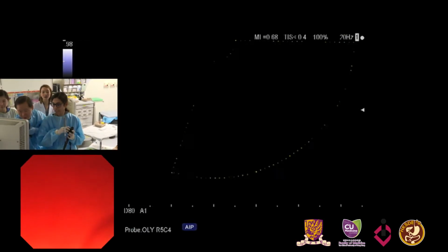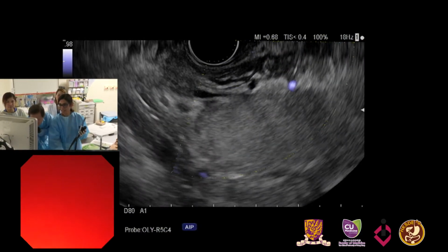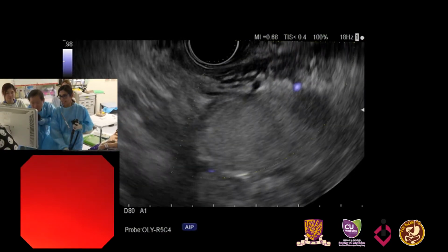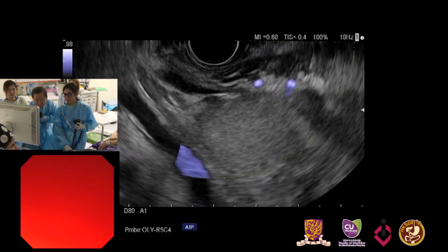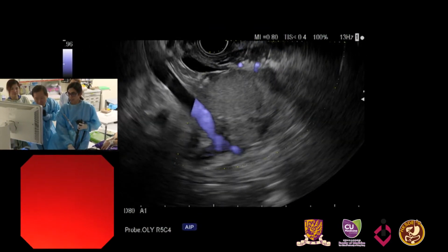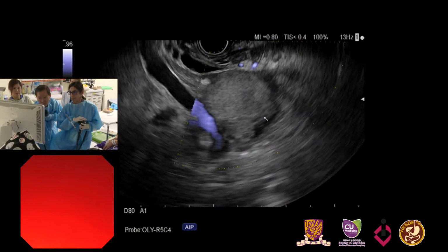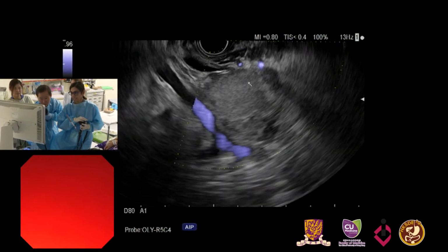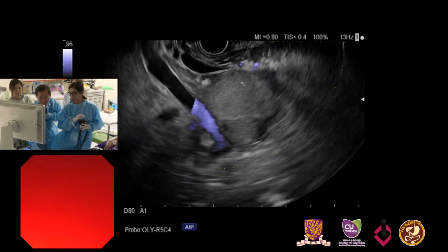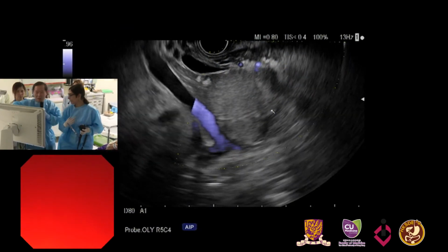So after we made 2 passes with the Moray forceps, after the second one, I noticed there was some active intracystic bleeding. If you can see the EUS image now, the cyst has completely filled up with blood. It stopped now that it refilled the collection. We wanted to demonstrate that issue.